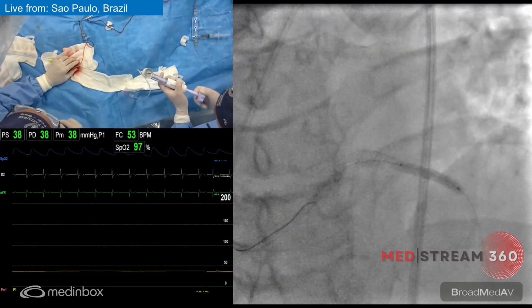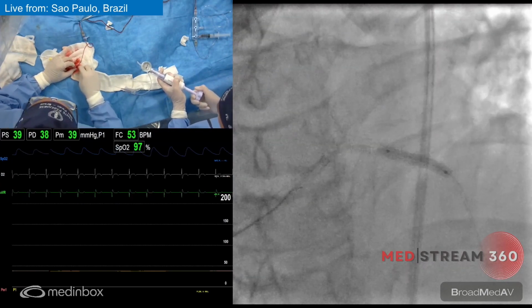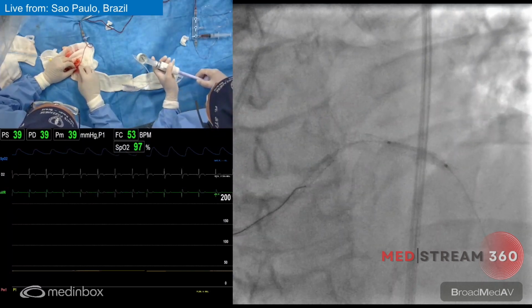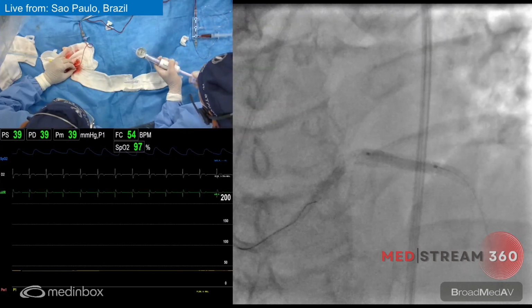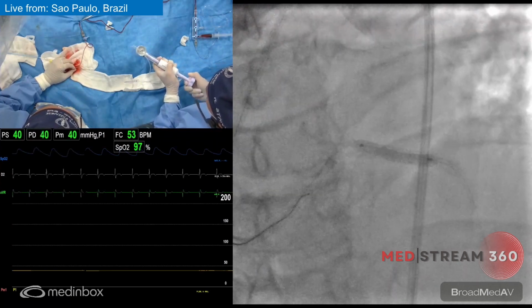Okay, Rodolfo. So 1 millimeter. Okay, so you're going up here, high pressure, right? 25. 25, okay. So now they are doing the post dilatation, optimizing the distance, which is also recommended to do everything you have to do within the stented segment, and then you can do the POT afterwards. I usually, that's what I do also in my practice.